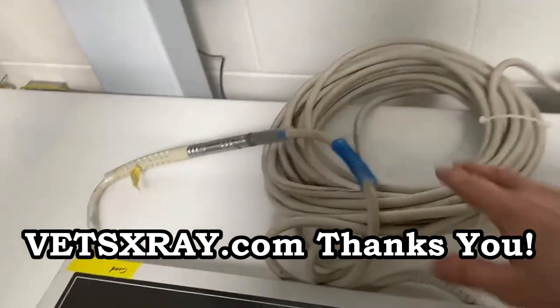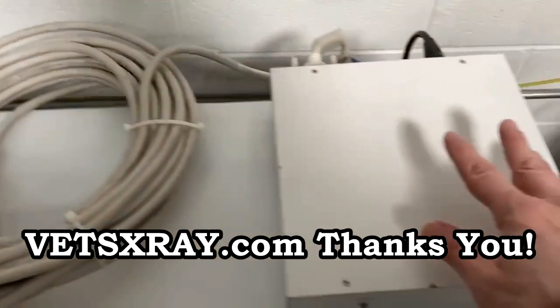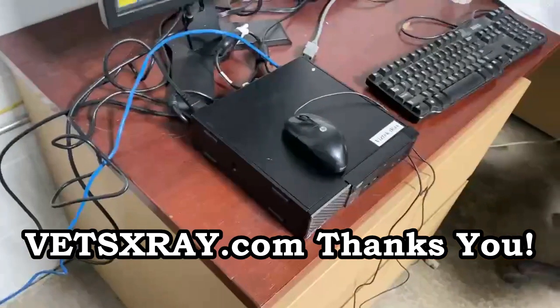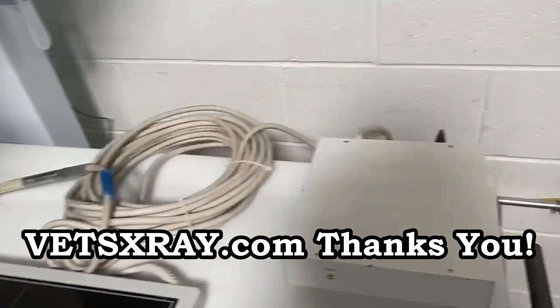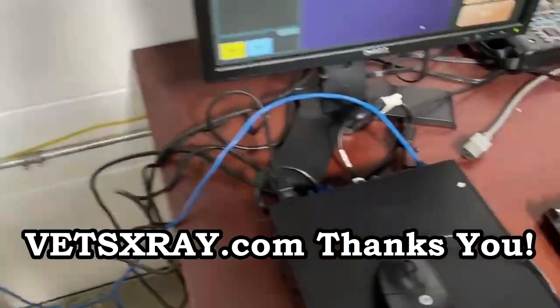It comes with a tethered cord here so that you don't need batteries for the panel. It runs into this connector box, which then has a network cable that will run over to the workstation. So you can put the panel as far away from the box as you want, or put that near the box and run the cable as far as you want.